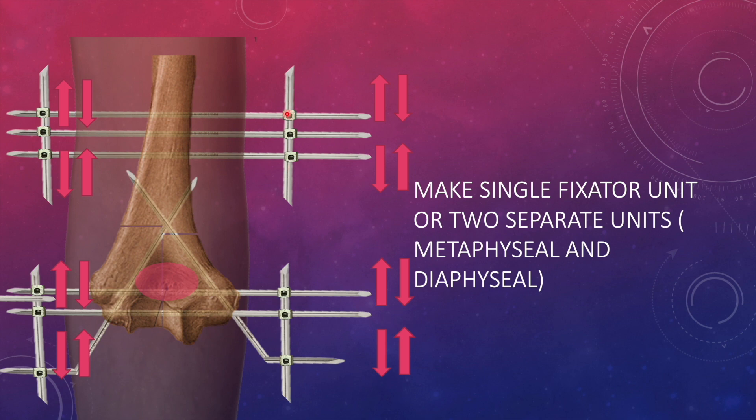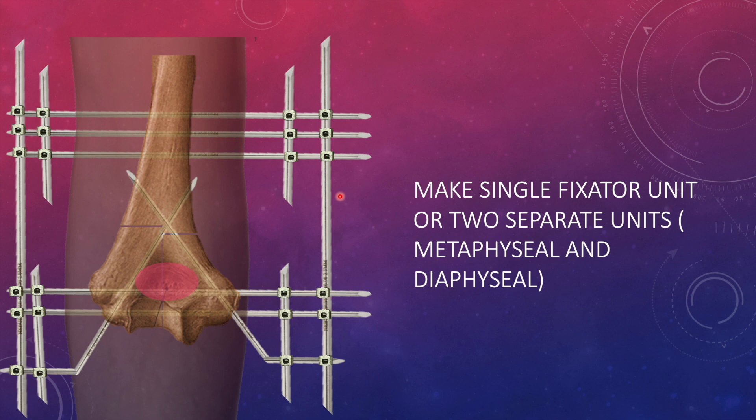Better would be to create a stable assembly of the diaphysis and metaphysis separately using small rods. You can pass the small rods on each side and then connect these two assemblies with the help of a large rod like this. This assembly is already tensioned and you have tensioned this assembly also. You can either converge or diverge the wire ends then tighten the clamp. Both of these assemblies are now tensioned.